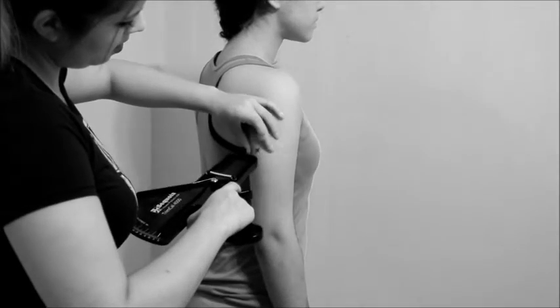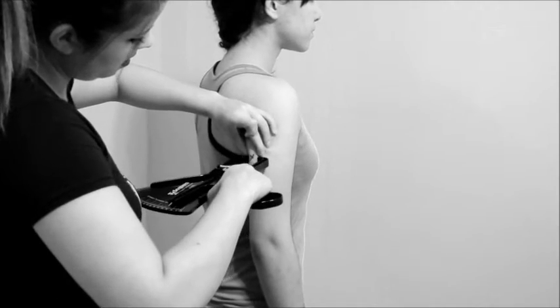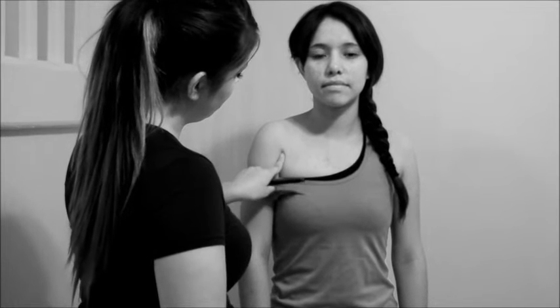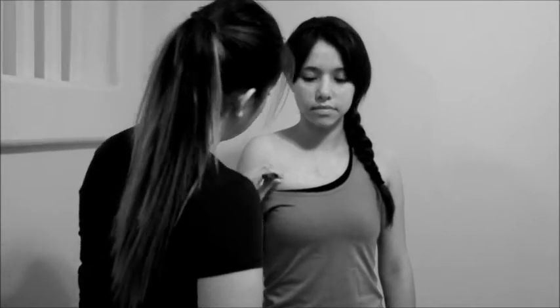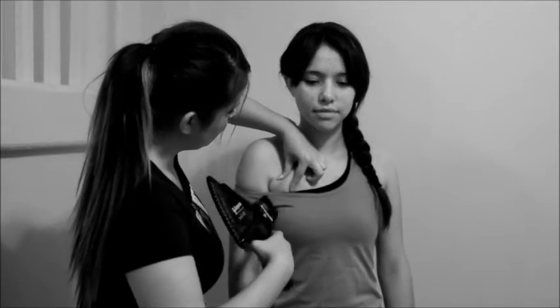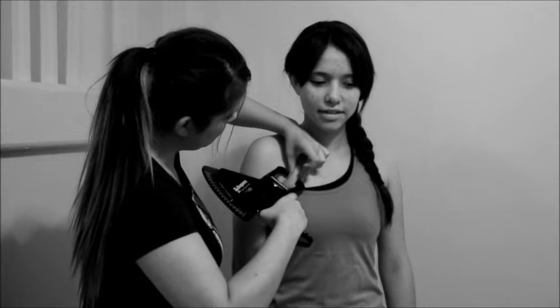With the arm held freely to the side of the body. Chest pectoral: diagonal fold at one-half the distance between the anterior axillary line and the nipple for men, or one-third of the distance between the anterior axillary line and the nipple for women.